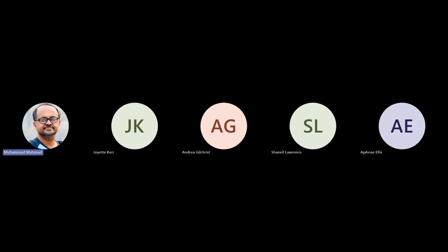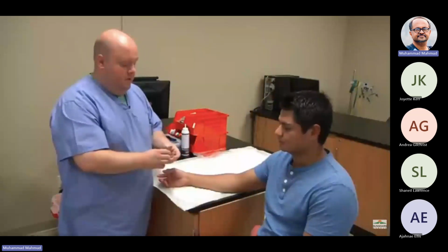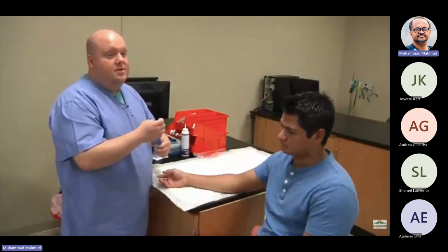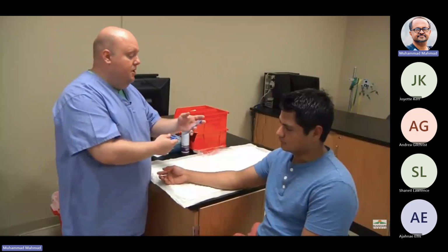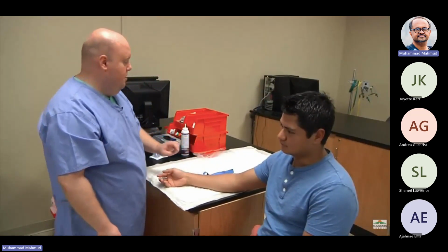Today we're going to learn how to do a tourniquet application, and we're also going to learn how to palpate for the veins that we will be accessing for phlebotomy. What you'll need for this is a tourniquet. You can use a new tourniquet, or a previously used one as long as you've wiped it off and cleaned it before using. We never reuse a tourniquet once blood or other soil contamination is on it.